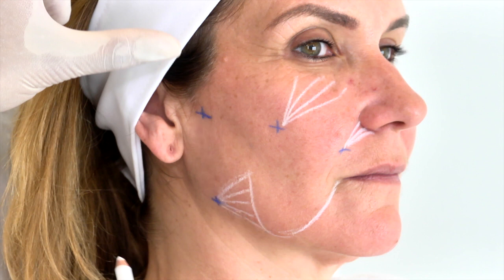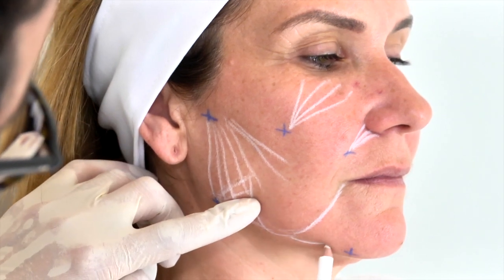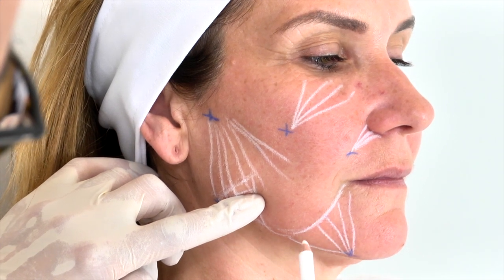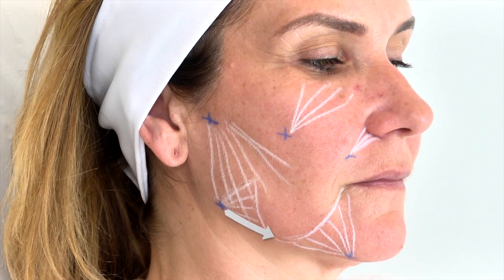The second step in treatment may be indicated alone if the oval loss only involves its anterior segment. The filling of the mandibular notch labial commissure triangle by Radiesse allows recovery of the mandibular linearity and the removal of the notch and marionette lines. Clinically, the mandibular notch is bordered by the anterior end, the para-chin, and a posterior end, the jowl. The cannula or needle is inserted at the anterior end of the mandibular notch.